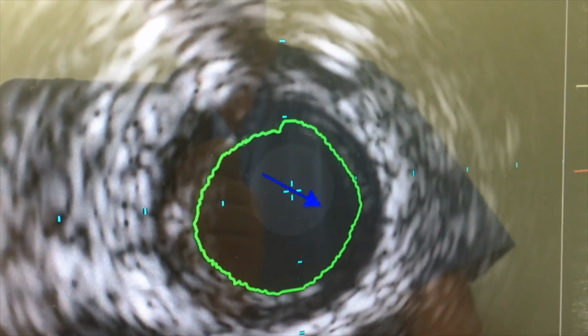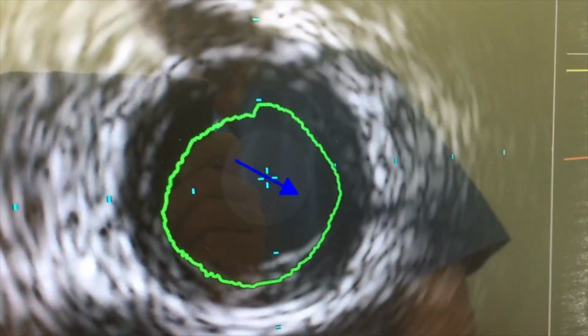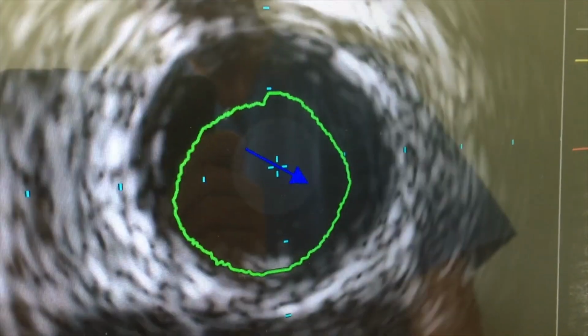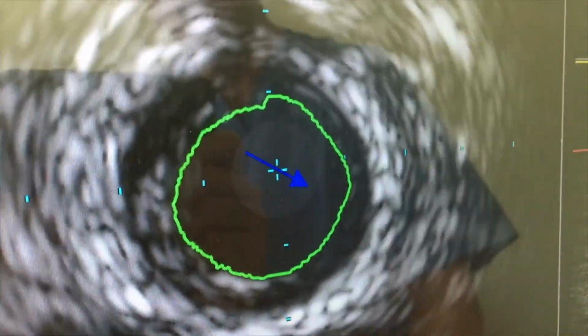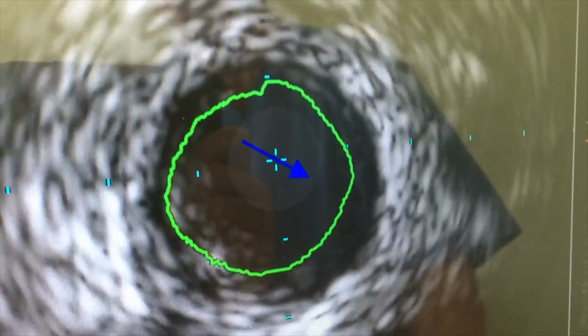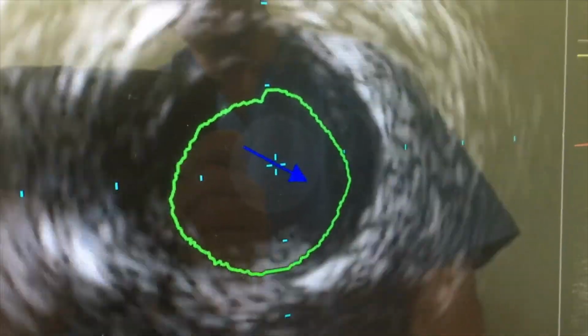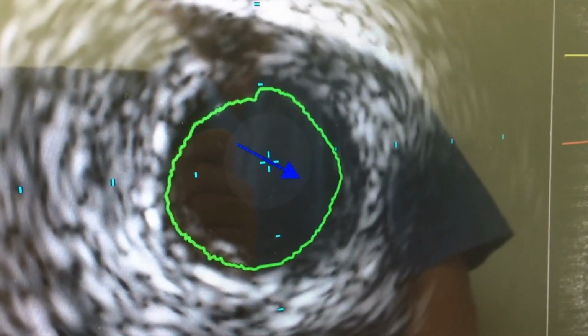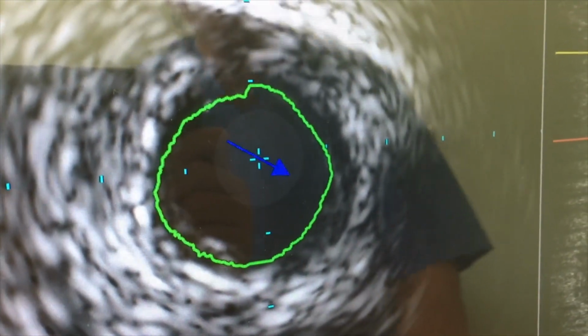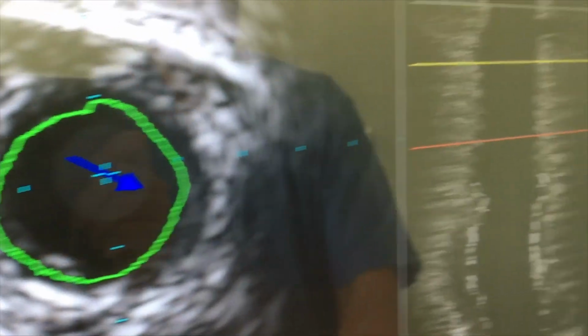I'm going to move the longitudinal section forward and back. This is there to compare the MLA of the lesion with the reference segment. So this is how you can compare what's the reference segment MLA and what's your MLA in the lumen.